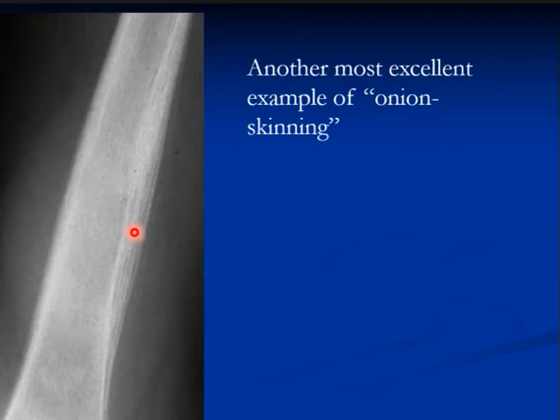And the diagnosis could be done by X-ray or, well, radiologically speaking, we can say there is a highly suspicious bone lesion. Biopsy is needed for histopathology confirmation. We have to do a biopsy.